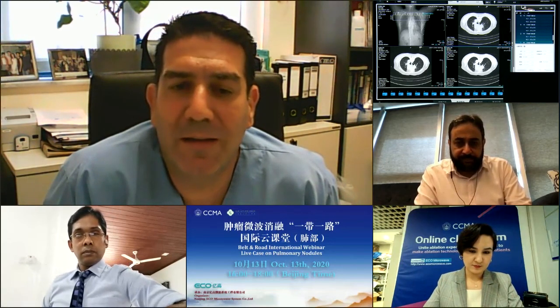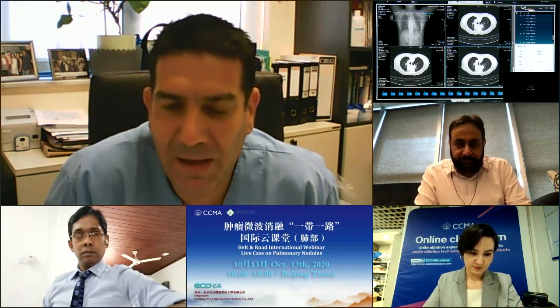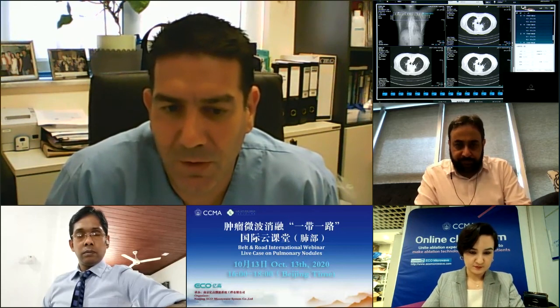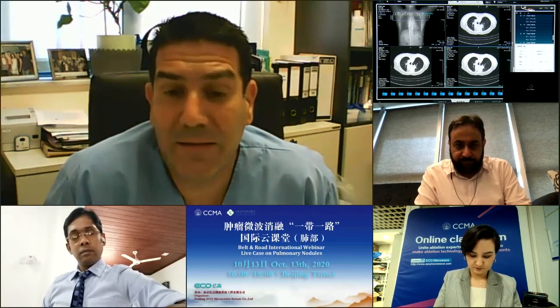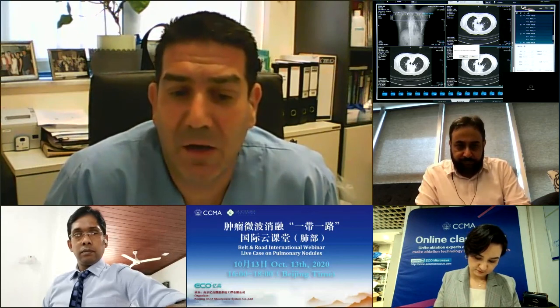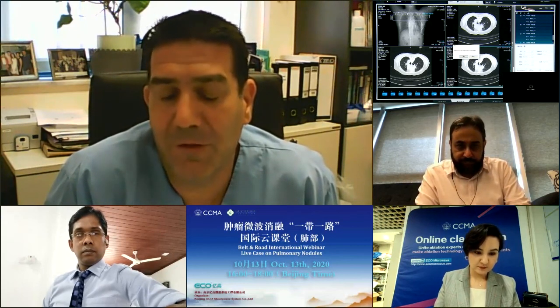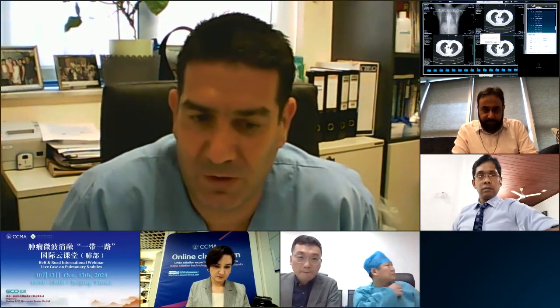My questions would be, for the biopsy, whether you risk damaging the microwave needle with the biopsy needle when you have both so close. And my second question is, would there be a risk of heat being transmitted along the metal of the biopsy coaxial shaft and having problems there? But I suppose they will answer these questions here. So congratulations for the excellent cases.